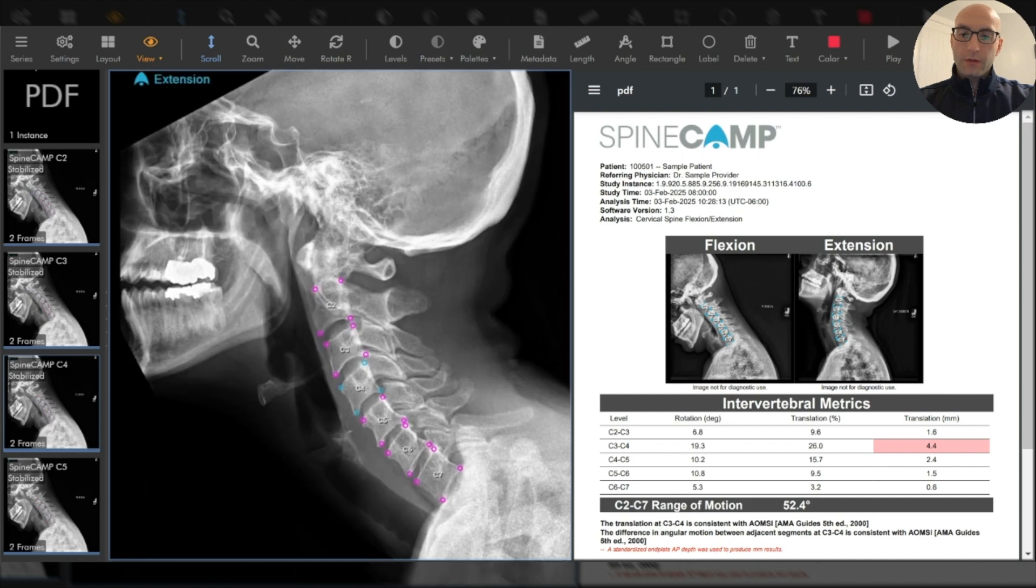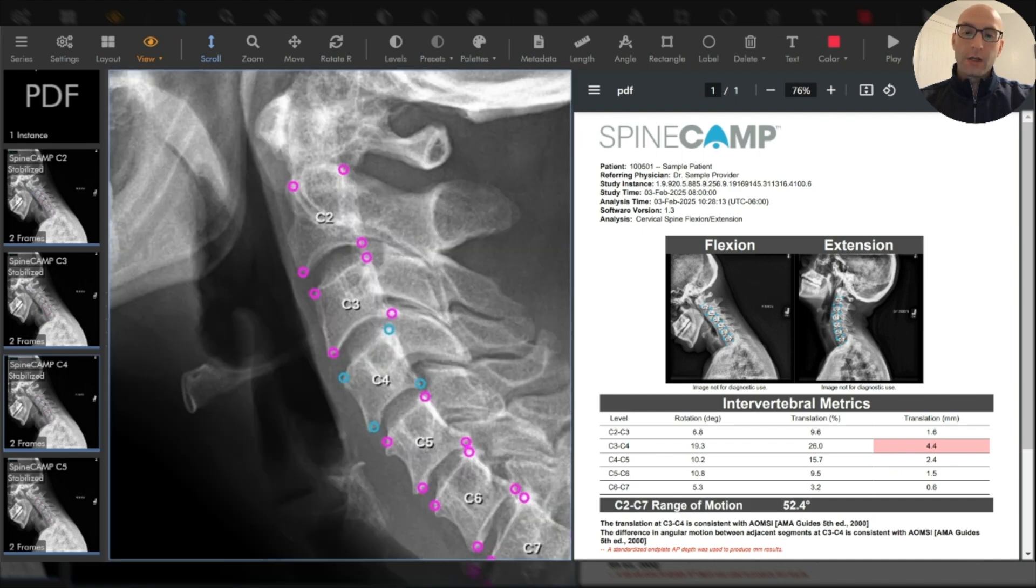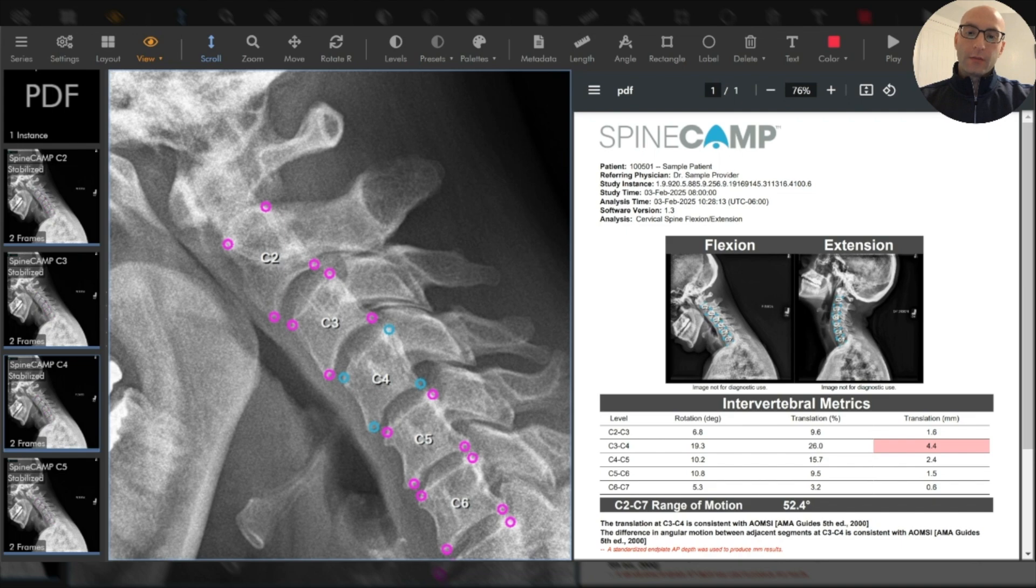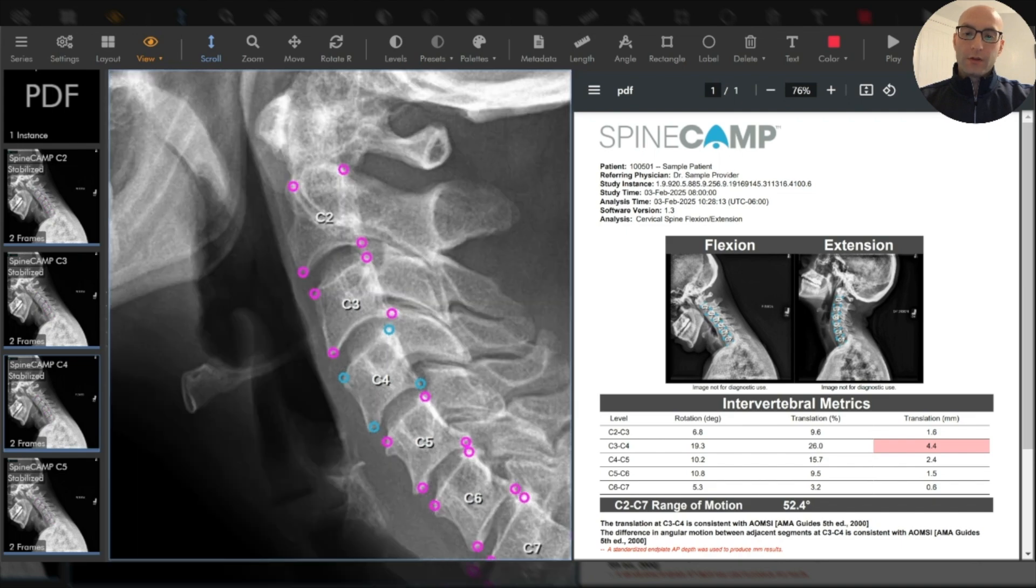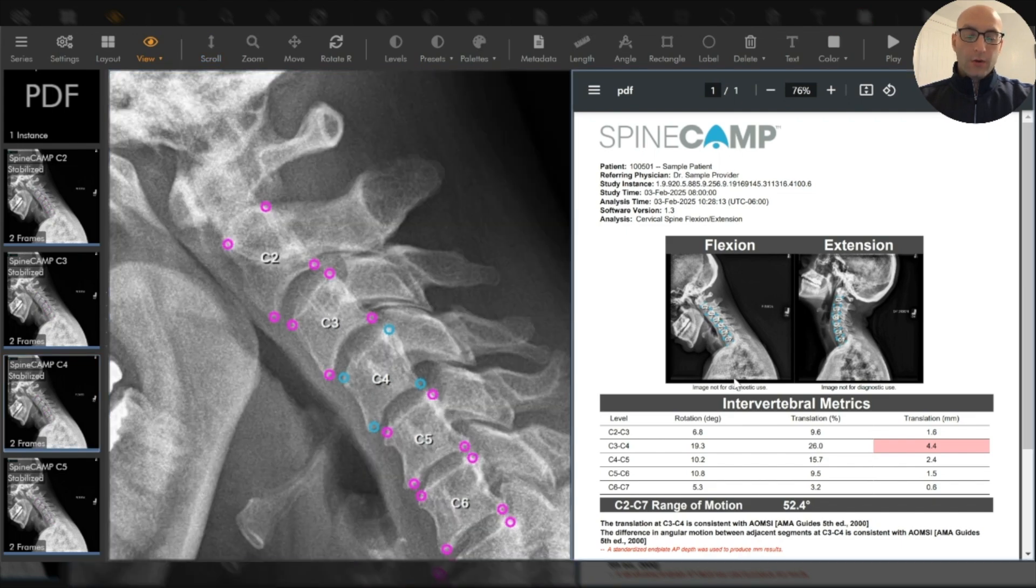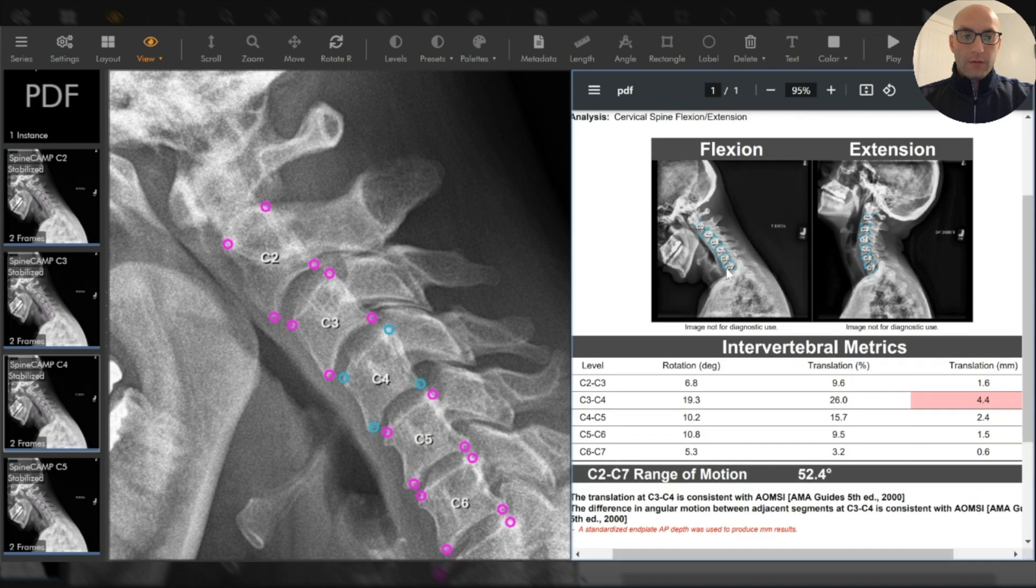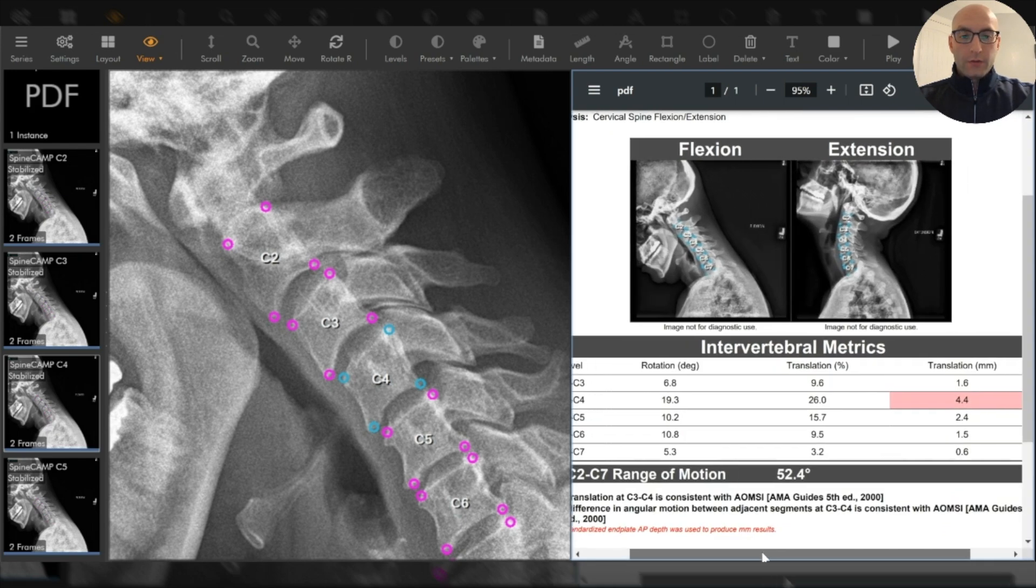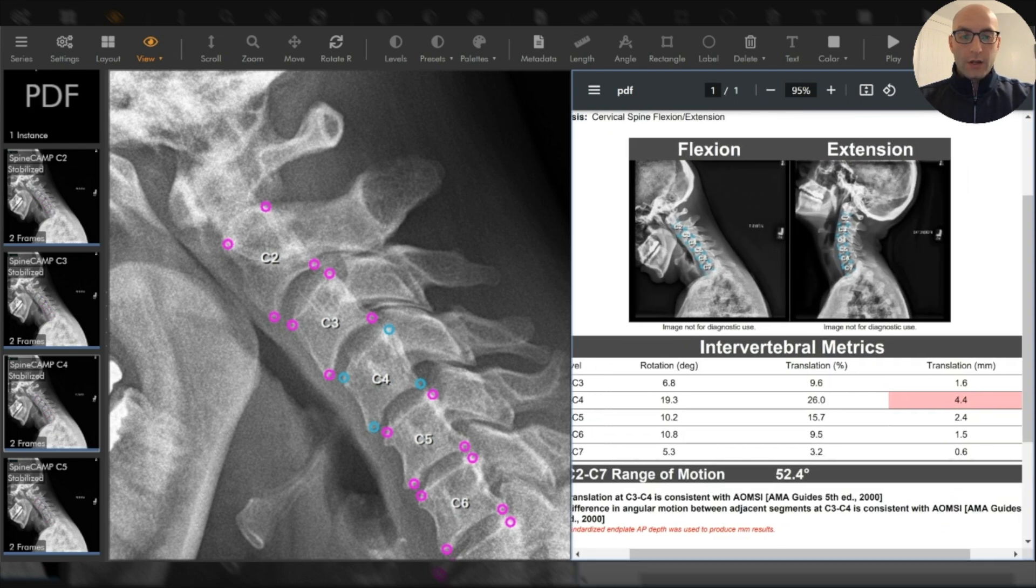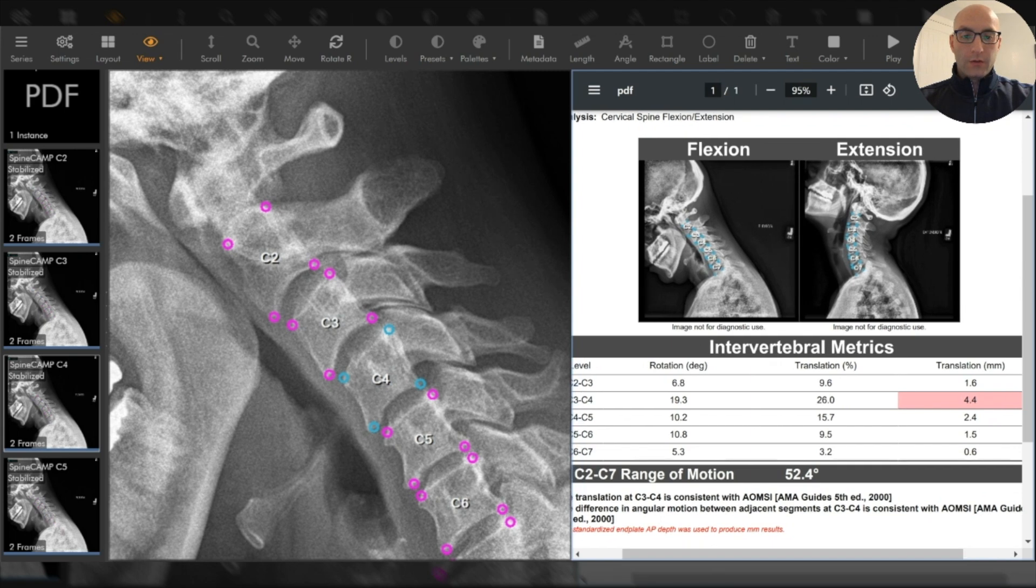This enables us to really appreciate the motion that's happening at a segment like C3 C4 in this case. And on the right, you can see that that type of motion is quantified and it's flagged. So we have rotation and translational measures at every single level here, as well as the global range of motion from C2 to C7.